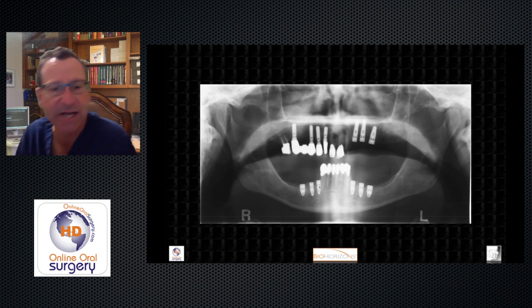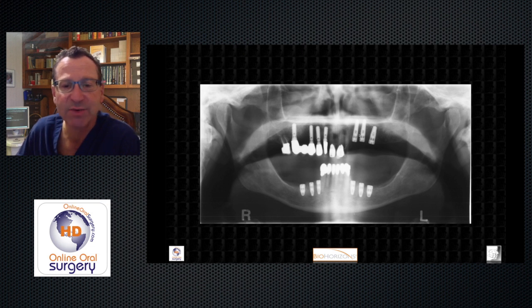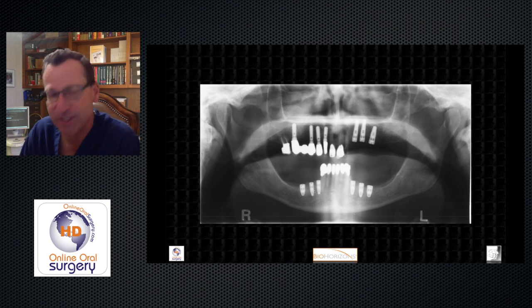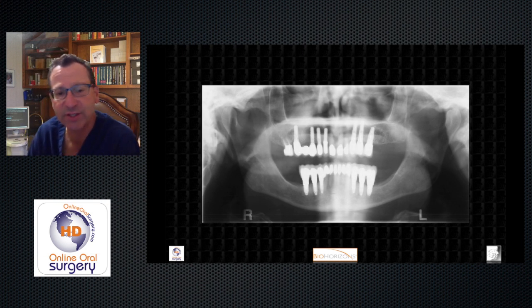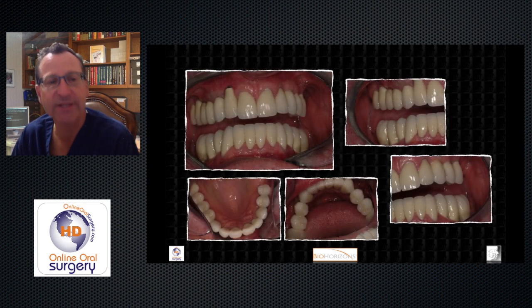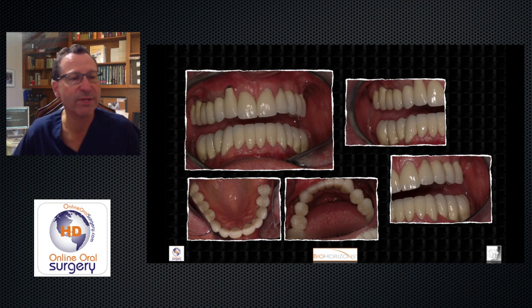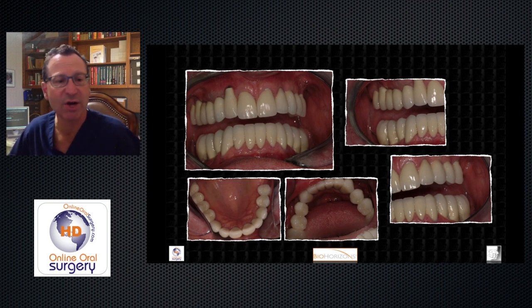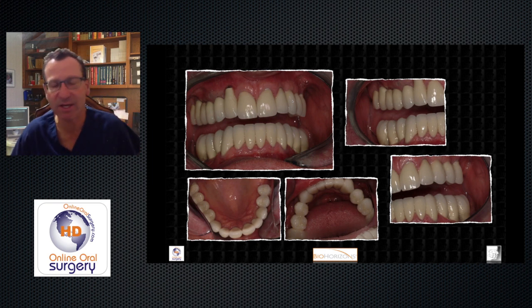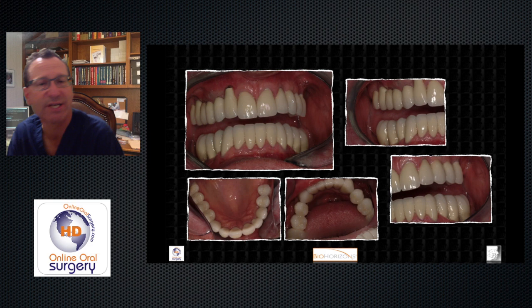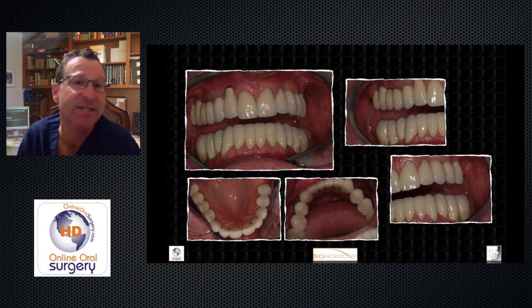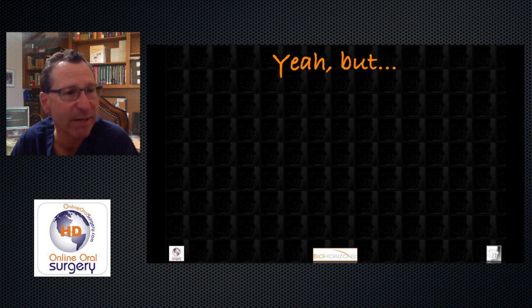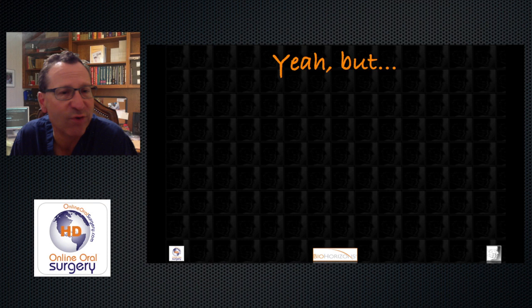Our plan: extract tooth number 15, do a left maxillary ridge split to widen the ridge and place implants at 12, 13, and 14, then place three implants on the right mandible and three on the left with some freeze-dried bone grafting on the facial at a few sites. The immediate post-op panoramic shows three implants upper left, three lower left, three lower right. After four months of integration and final restoration, the patient was ecstatic — and even more ecstatic was the patient's dentist, who said this was probably one of the easiest implant cases he'd ever done.